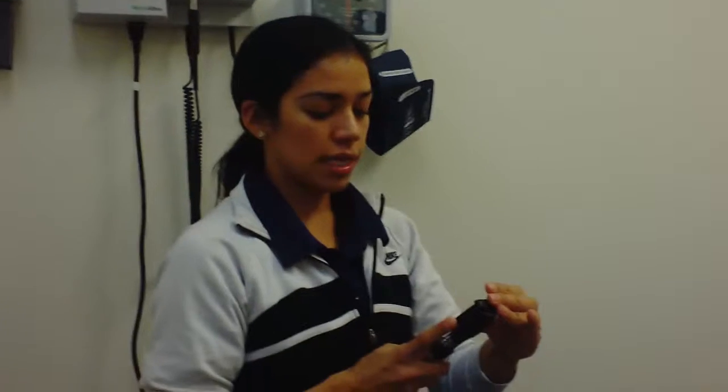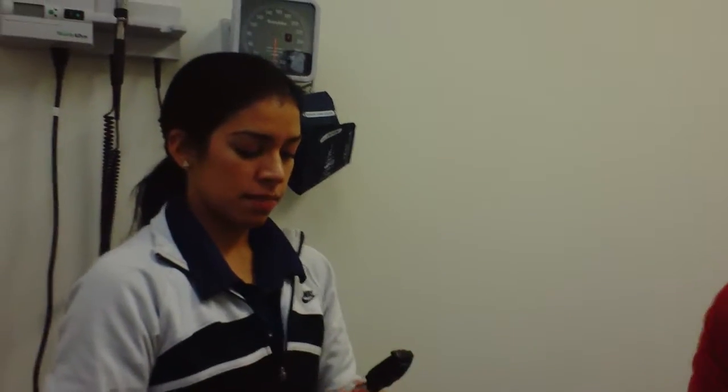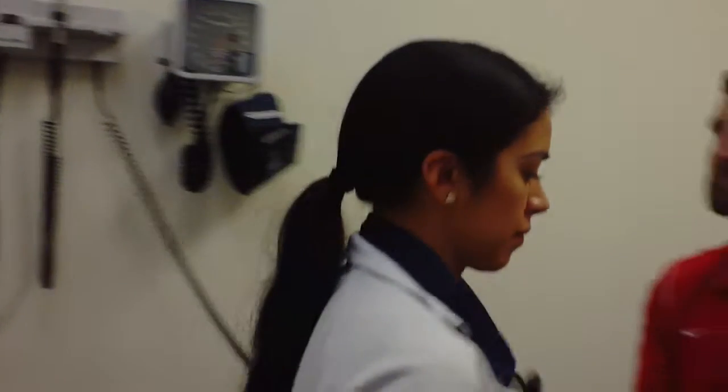Alright, so then I would do the same for the other eye and have him just stare at one place so that his eyes don't wander. Next, I'm going to examine his retina. I'm going to do his left eye. So I'm going to hold the ophthalmoscope with my left hand. Alright. So I was able to see the retina and the optic disc.